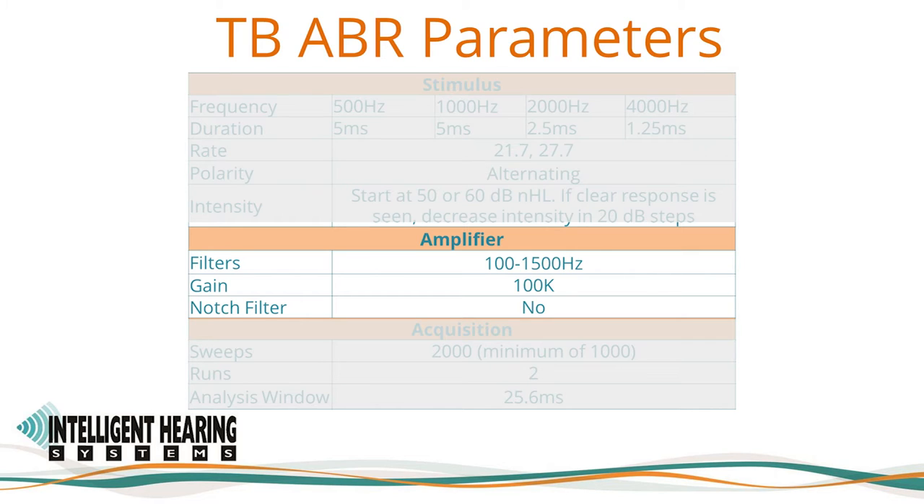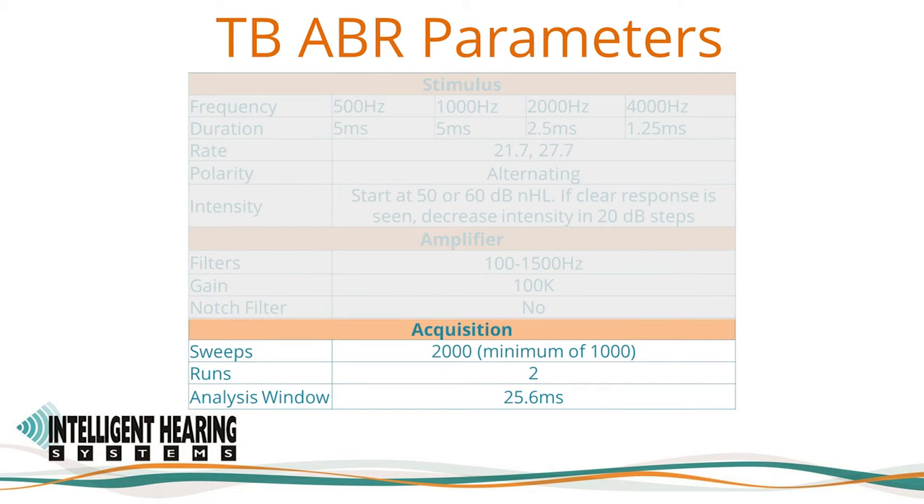The notch filter — 60 Hz or 50 Hz depending on your location — is turned off, but can be activated to reduce line noise when needed. Sweeps are the sample size or number of repetitions. The more you average, the more likely you will eliminate noise and increase response clarity. Commonly used sweep counts include 1024 for clicks and 2048 for tone-burst ABR. A minimum of 1000 sweeps is always needed to ensure a stable response. Reliability can be evaluated by repeating an average at least once, or by use of valid response detection criteria such as SNR and residual noise, or FSP.